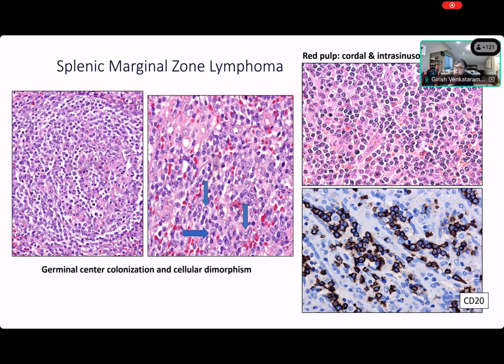And on the right side on the top, you can see the red pulp with a lot of diffuse lymphoid involvement. So you can have red pulp involvement too in marginal zone lymphoma. So don't just bank on all the cells being in the white pulp before you make a diagnosis, right? Thankfully, we don't have to look at a spleen to make a diagnosis of a marginal zone lymphoma. We look at a peripheral blood, we look at a marrow, we can make inference. That's easy, right? And it's always inferential.